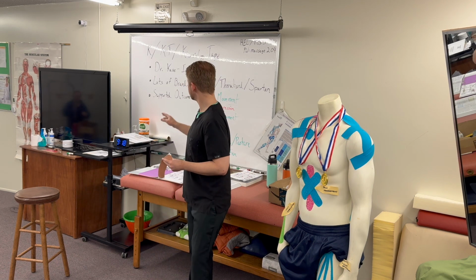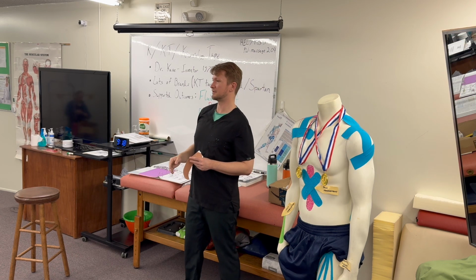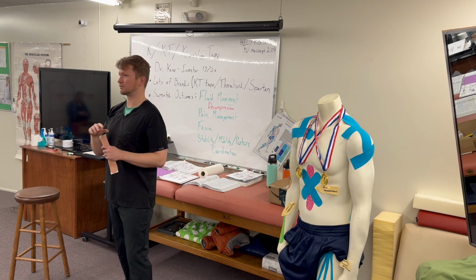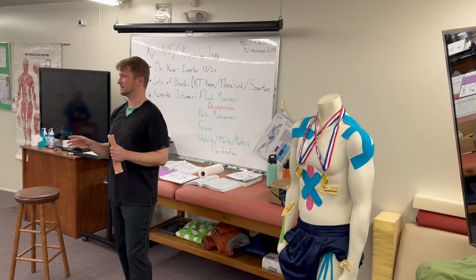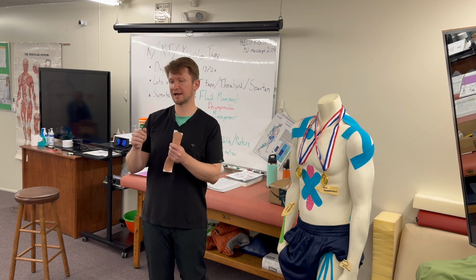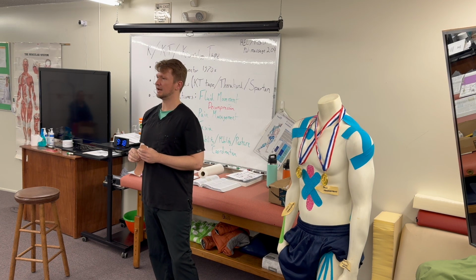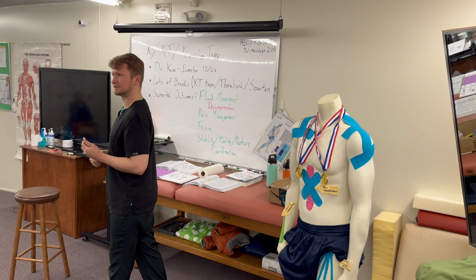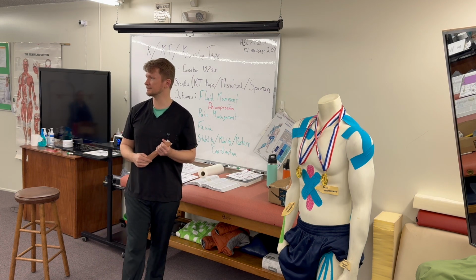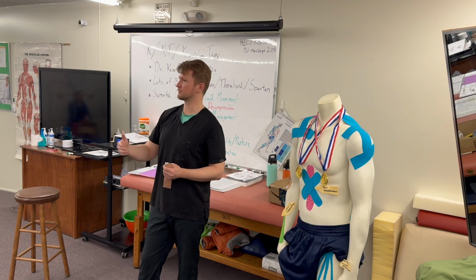But the KT tape brand, and you'll find it anywhere. You can find it at almost any Rite Aid, Walgreens, anywhere. You have options for just the original, kind of the classic, and then there's the sports ones, and those end up having a bit more rigidity. They feel a little bit tougher, and they're more waterproof. So when people are going to be more active, they're going to wear it for a few days, they're going to potentially sweat, and especially in exposure to water, the sport ones will hold up better.